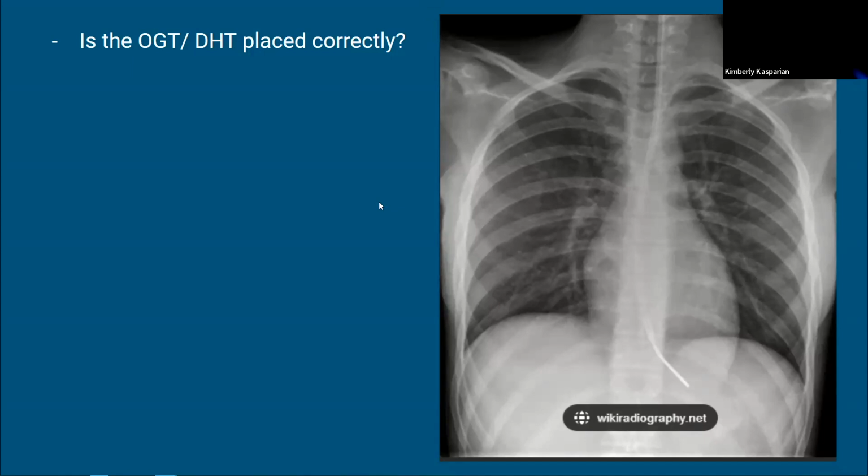Yep. That's right. So these are a little bit of a judgment call, but I think I might have found something on UpToDate. It actually gave a number. Do y'all know how far past the diaphragm you want to go? Probably like 5? Close, 10 centimeters. That was my second guess. So, yeah, 10 centimeters past the diaphragm.